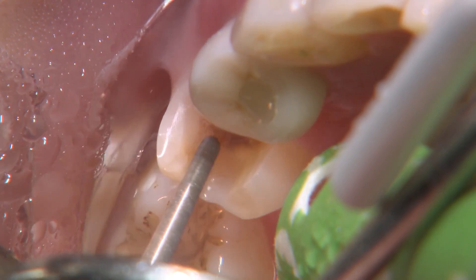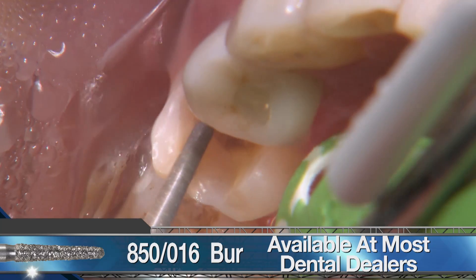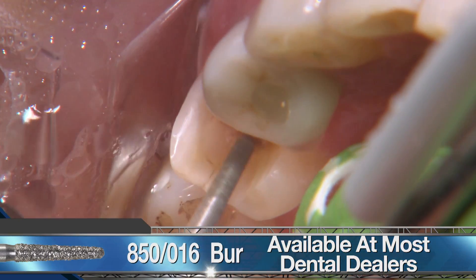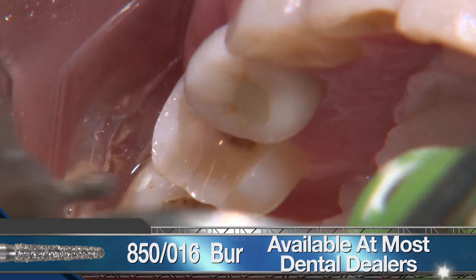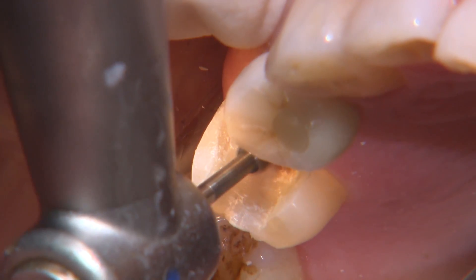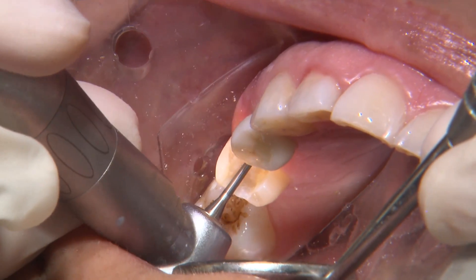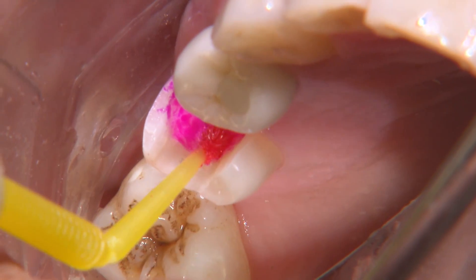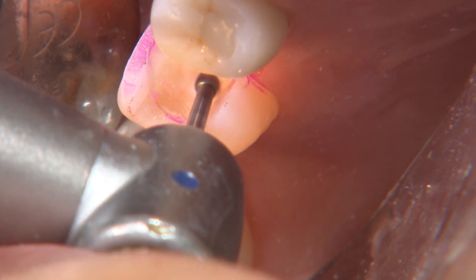Because caries spreads laterally along the DEJ, I use a coarse-grit 850-016 diamond to extend the cavity along the DEJ in all directions until the caries is isolated and only the dentin remains. Once I reach healthy DEJ around the cavity, I use a carbide round burr to remove the remaining decay. I like using a caries indicator dye to help verify that I've removed most of the demineralized tissue.